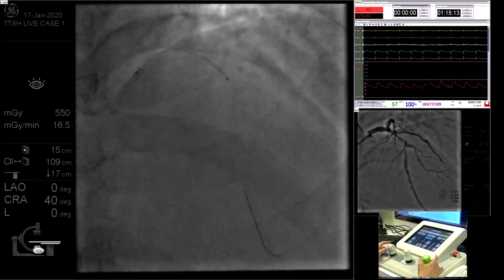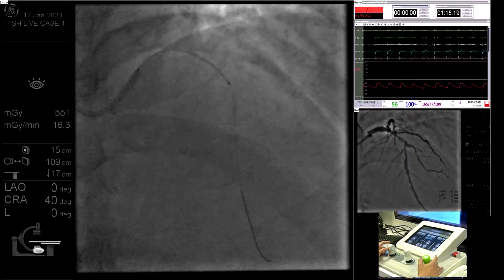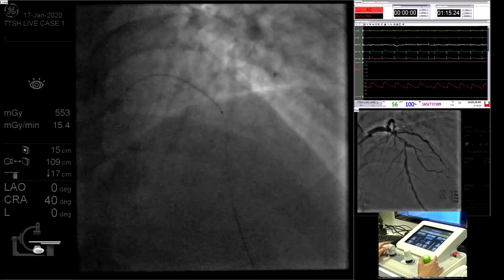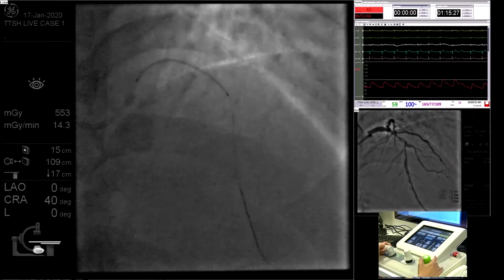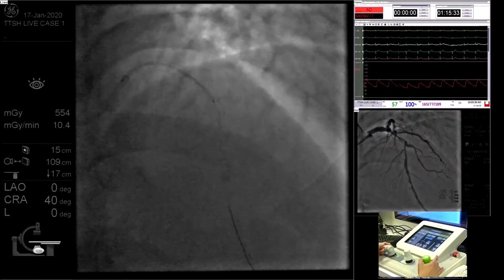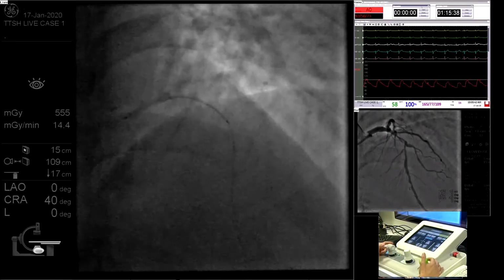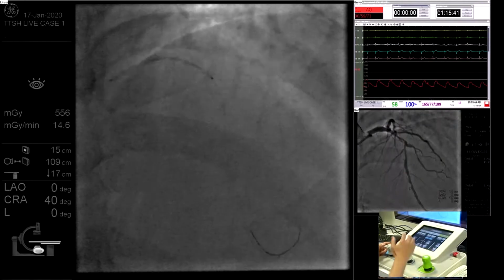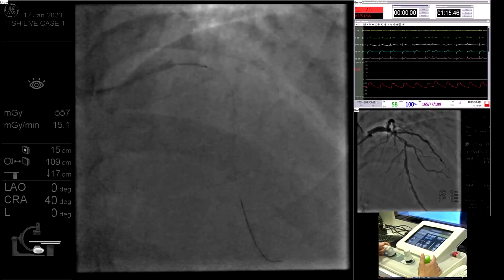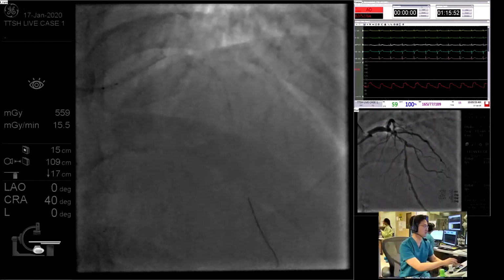Yeah, that's a little bit of a calcified band there, right? Let's see, if it doesn't go, I will put in... I saw a ring of calcium on IVUS before, but just on the robot. Tell you what, let's not. We have time, so I'm going to pull this stent back and dilate with a bigger balloon. I see the guide got sucked in, so I'm going to pull the wire back a little bit, put the stent back, and pull the guide back. Yeah, and then get the guide back in. Okay, so I'm going to rewire this.